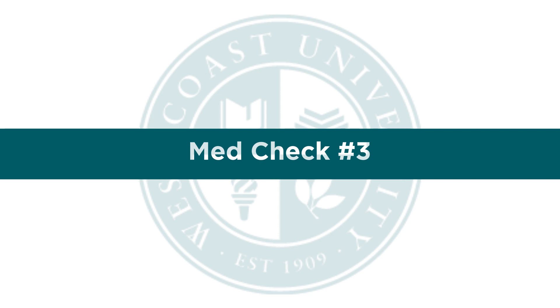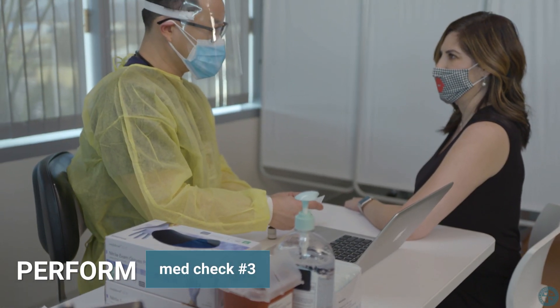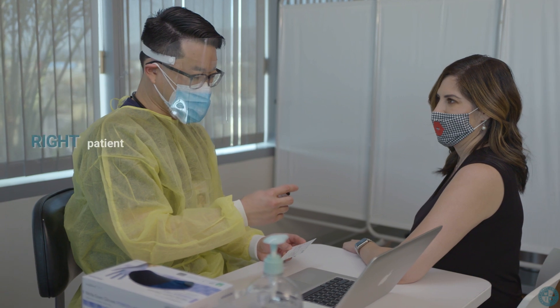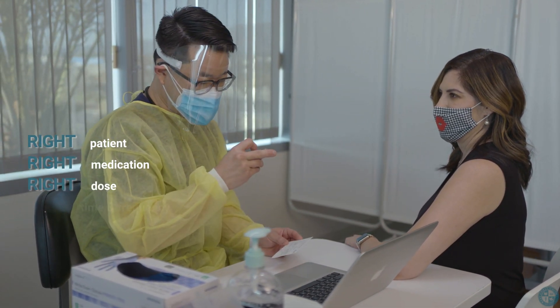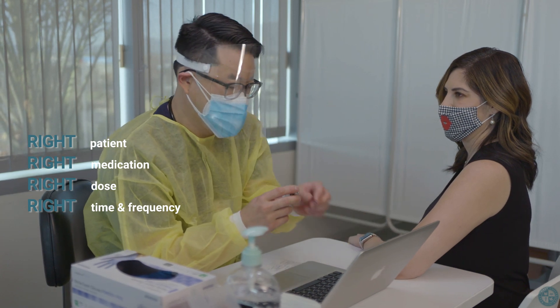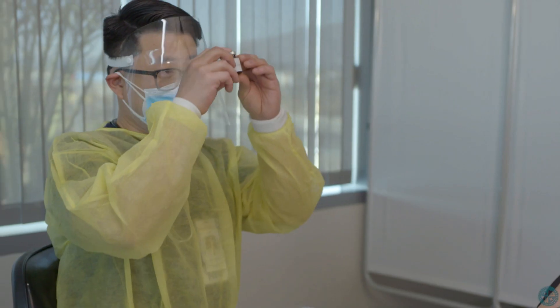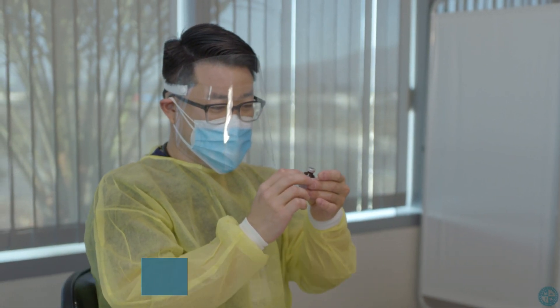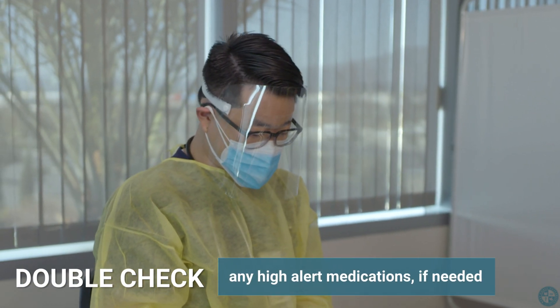MedCheck 3. The final step before administering the vaccine is a third medication check. This includes the six rights of medication: right patient, right medication, right dose, right time and frequency, right documentation, and right route. After all medication checks are complete, perform any drug calculations if needed, and double check any high alert medications if needed.